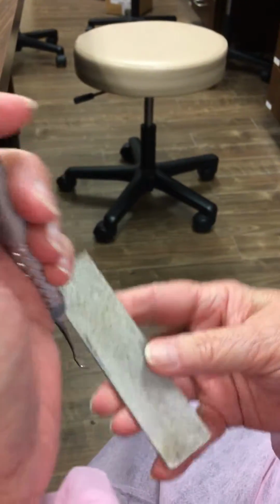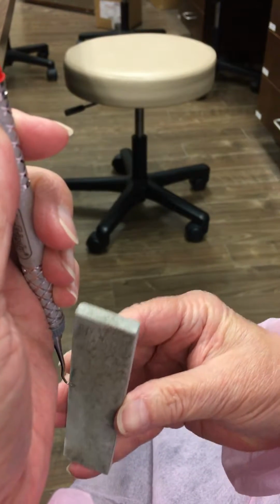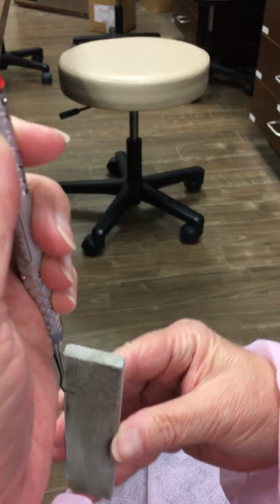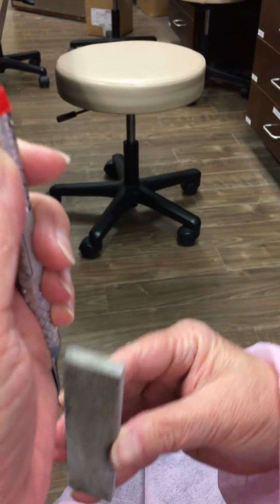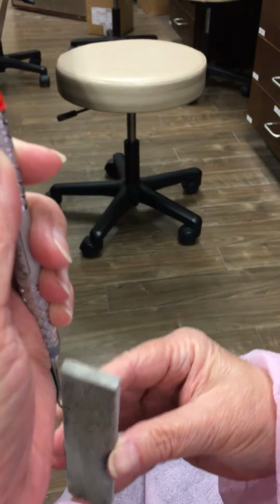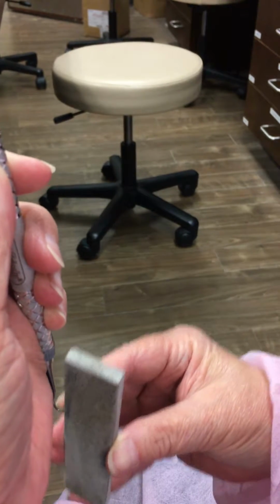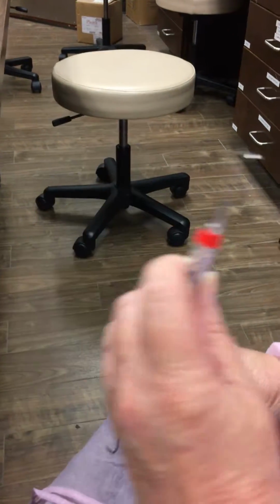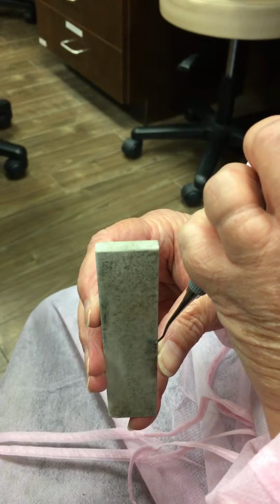I've oiled my stone with just some engine oil, using the Arkansas oil stone. Again, I started at 90 and then I open to 110 and just sharpen until I get sludge. And finish with the down. Now I'm going to turn it and do the other blade.